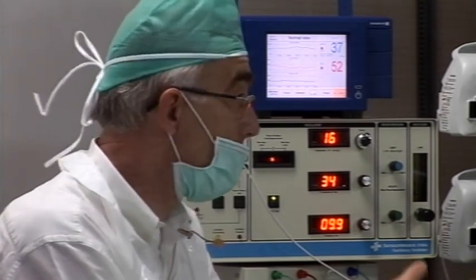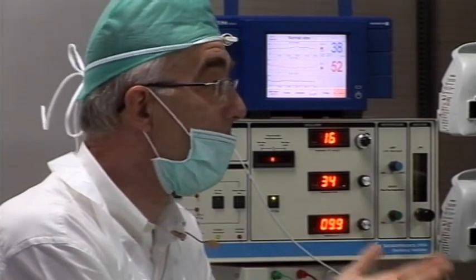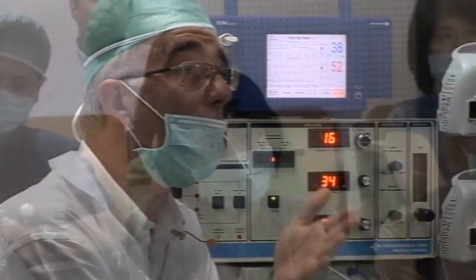The result that I told you about, 5 days on ventilation, was before we were routinely using CPAP. So we further improved when we started to use proper CPAP. We had a lot of resistance from nurses to use CPAP in our unit. They wanted the HFOV.